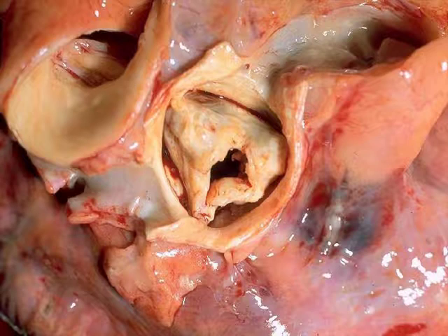You can imagine that with the heart beating, an aortic valve such as this with severe aortic stenosis would require an increased left ventricular pressure to push blood out through the stenotic aortic valve. In addition, an aortic valve with such severely fused leaflets may also possess some aortic insufficiency, as the leaflets are not able to close fully during diastole.